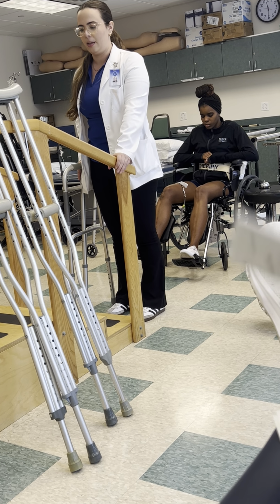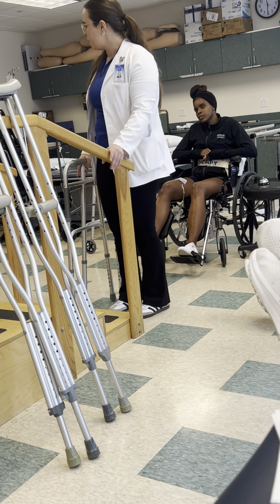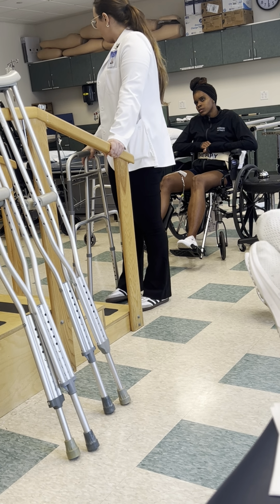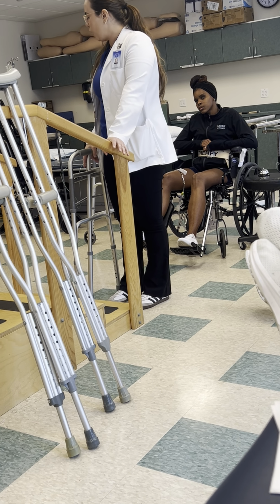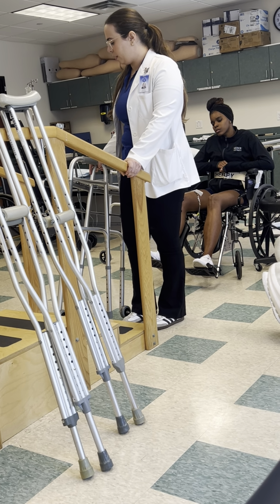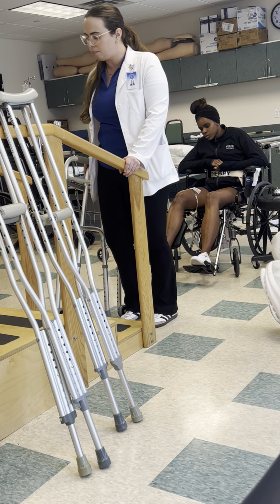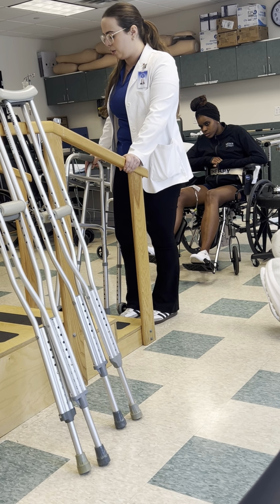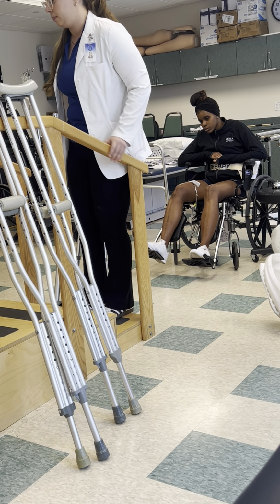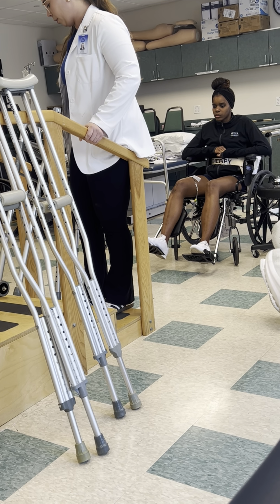So this is the point where I'll tell my patient what's going to happen, right? We're going to come up to the stairs. You're going to have your device next to you. I will be on your right side, okay? And what I want you to do is you're going to put the assistive device first, your rolling walker first, right? Then you'll lead with your uninvolved and then involved, okay? Do you understand?